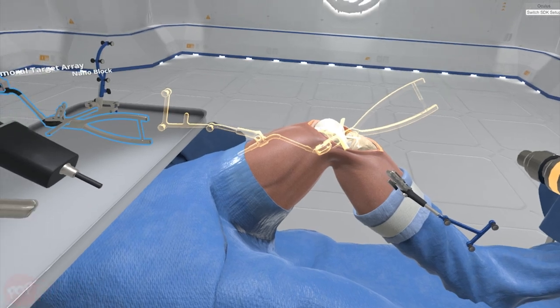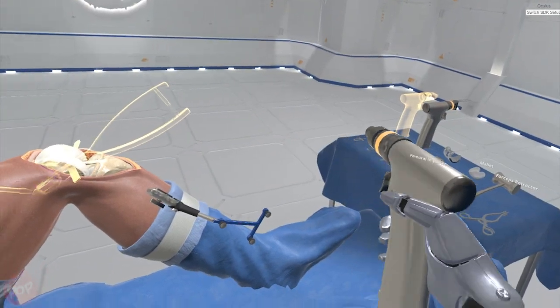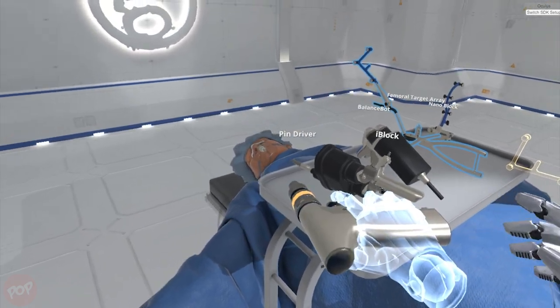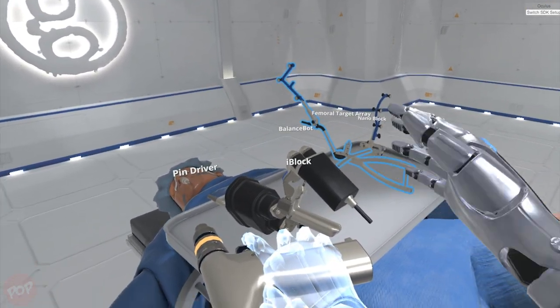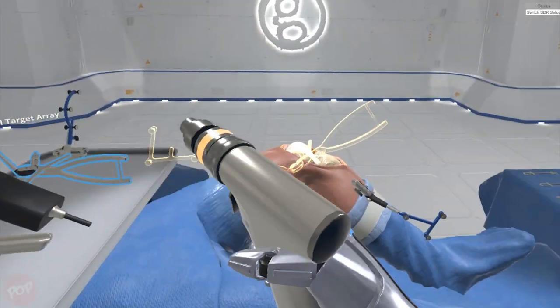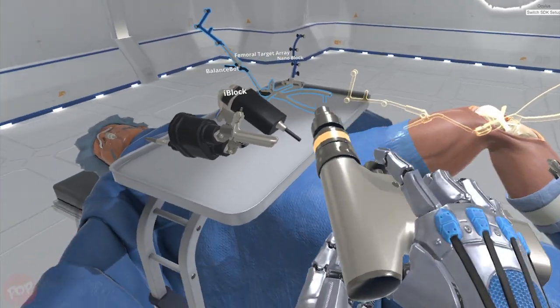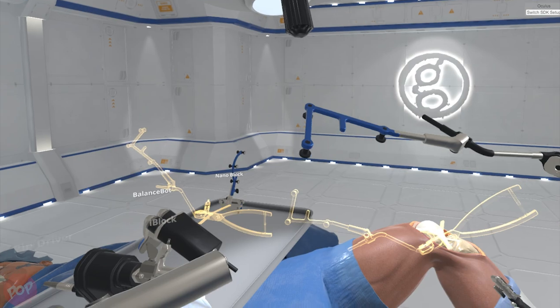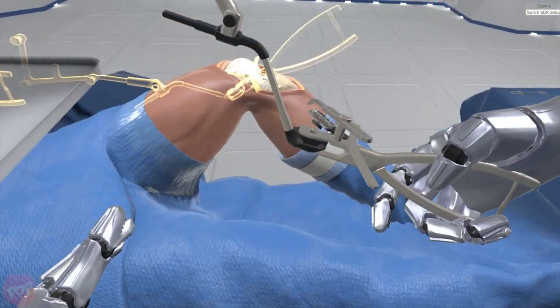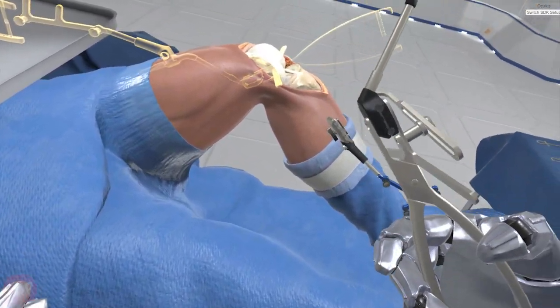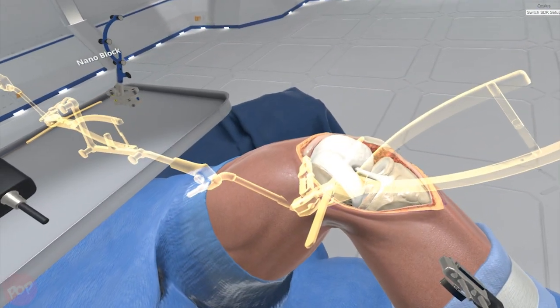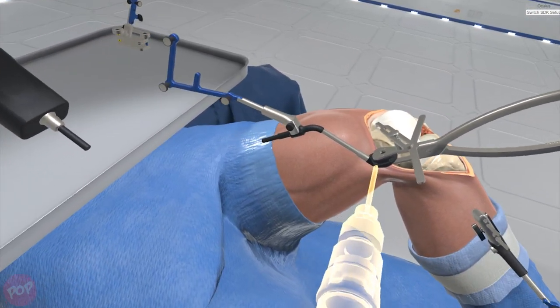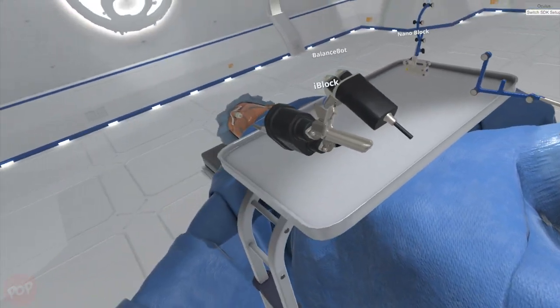Now select the femoral target array already mounted to the eye block femoral cutting guide robot fixation base. Place it along the medial aspect of the distal femur. The fixation base clamp will help find the proper anchor placement.